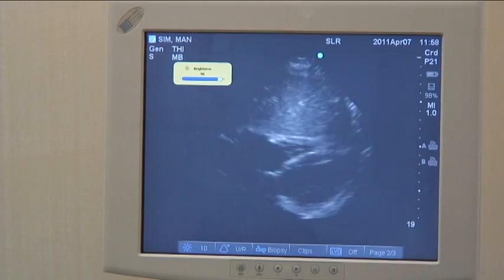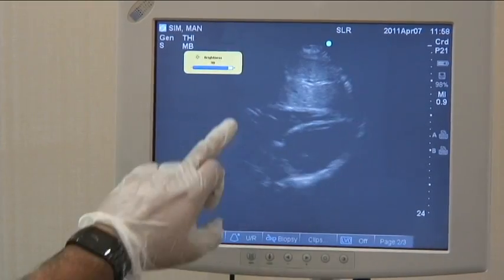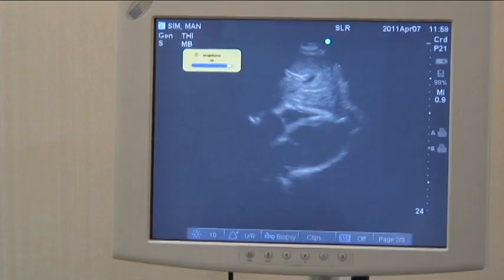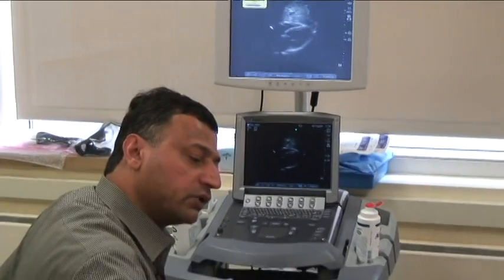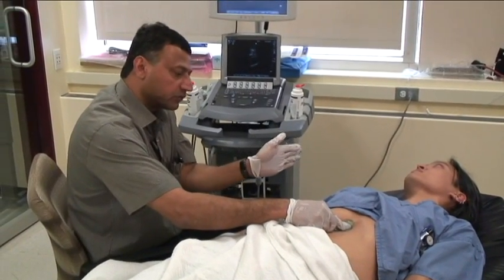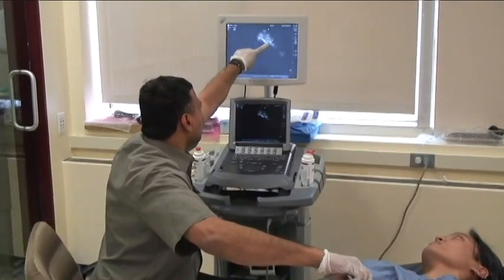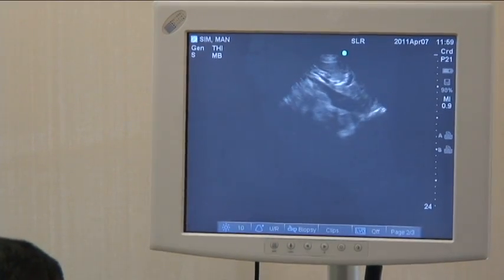And you notice I go down on the down button, now I have the heart nicely here in a perfect textbook image. It's your right atrium, your right ventricle, your left atrium, your left ventricle. Once you have this image, let me just lift this a little bit. This is your subcostal view. Once you have this image, because the IVC lies perpendicular and about 1 to 2 centimeters to the right of the spine, what you're going to do is rotate counterclockwise. You're going to look at the screen and see what happens. You rotate counterclockwise and the IVC should slowly appear here and look to the right. Now that's your IVC right there.